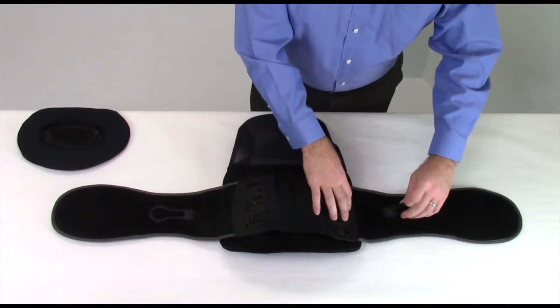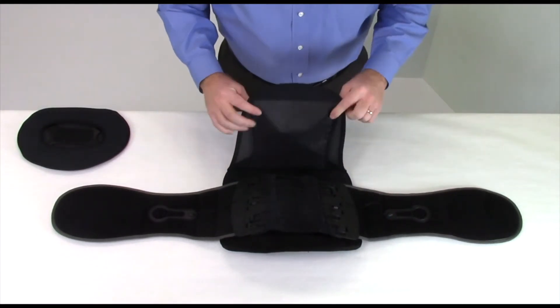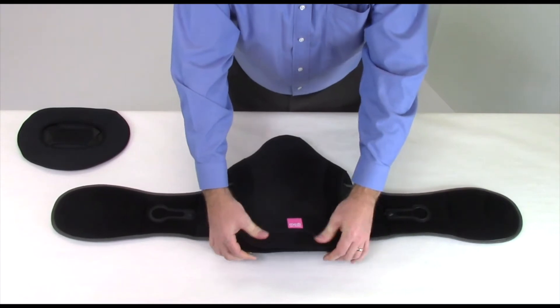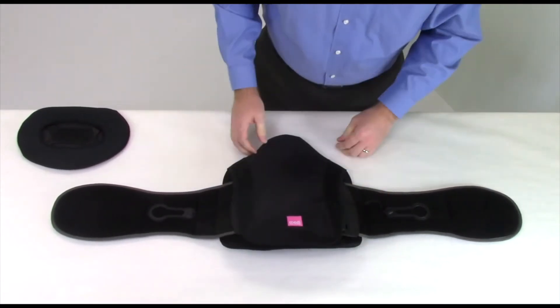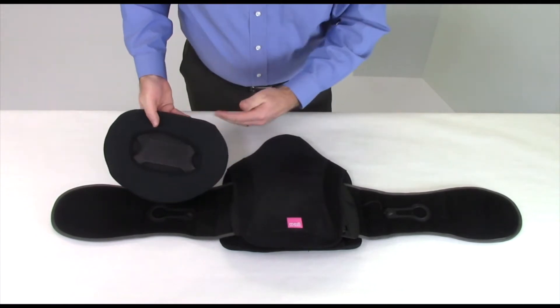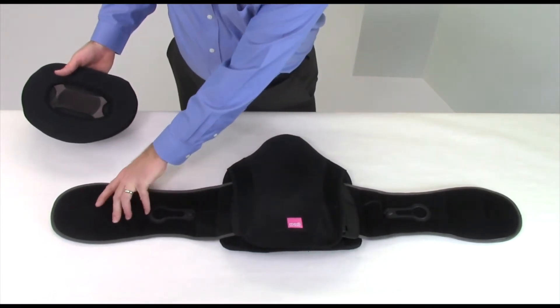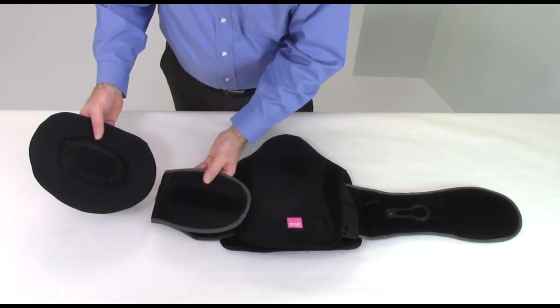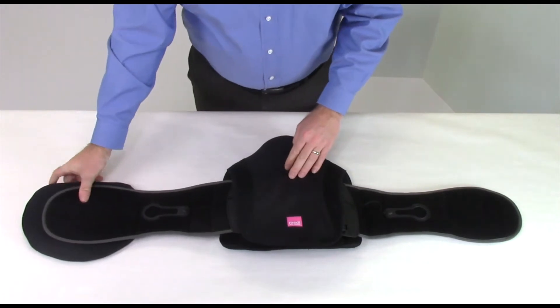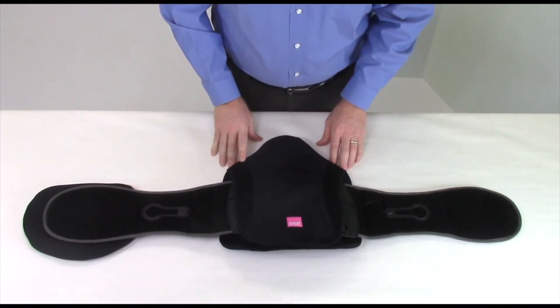Close the back cover by fastening it to the Velcro closure at the bottom. Next, fasten the oval front panel with the flat edge towards the top to the inside of the left wrap panel so that it is centered over the abdomen when the device is worn. If further adjustment is needed after trying the device on, repeat these steps and resize the wrap panels as necessary.